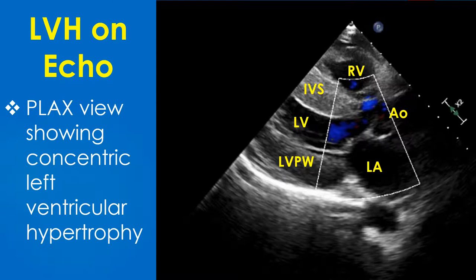Discussion on left ventricular hypertrophy on echocardiogram. Parasternal long axis view showing concentric left ventricular hypertrophy. Both the interventricular septum and left ventricular posterior wall are thickened significantly.